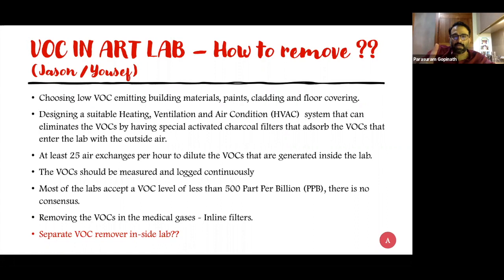But there's one question I'd like to ask in this particular area about VOCs. We talk about keeping carbon filters in the AHU line, or do you intend to keep a separate VOC remover inside the room? I see a lot of companies coming up with separate units. You remember a lot of times we had these large Coda towers kept inside the room for VOCs. We had an AHU separately, and then we had these Coda towers. But if you actually have a carbon filter inside your AHU, do we really need those, or can we get away with not using them?